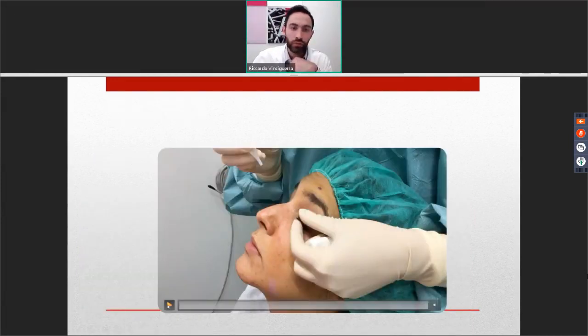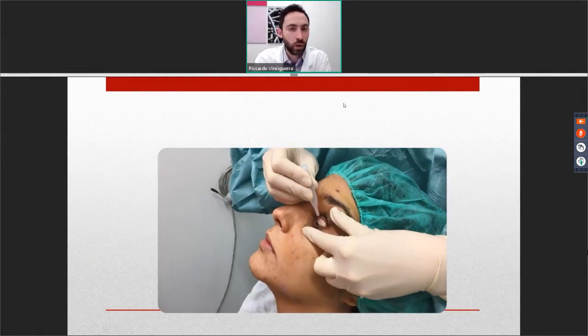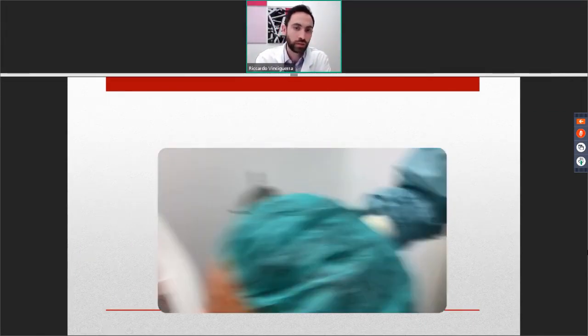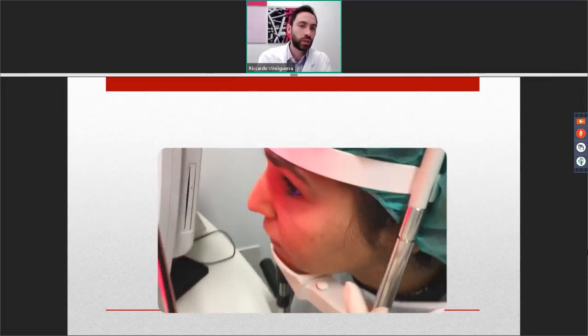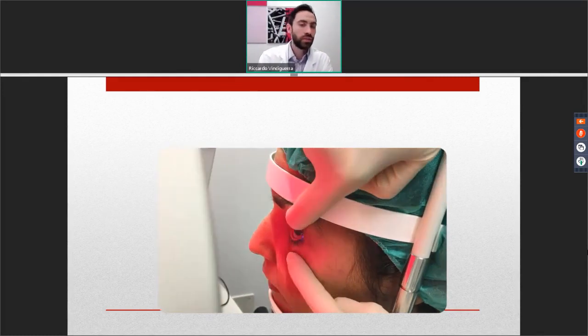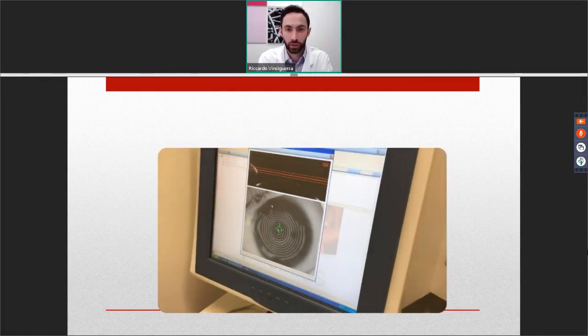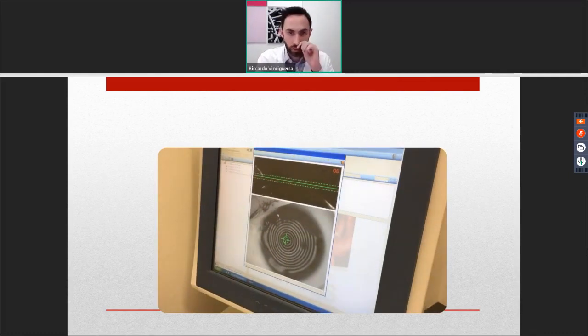We obviously have the right to show you this. So this is the patient without epithelium. We put a drop of masking fluid, and then we acquire the patient on the SCHWIND software. Now you can see a perfectly good keratoscopy, and this is without epithelium. So you can use this to do other steps.